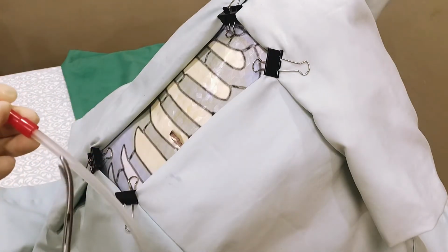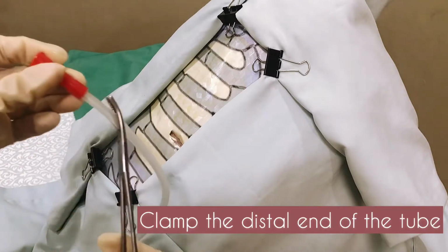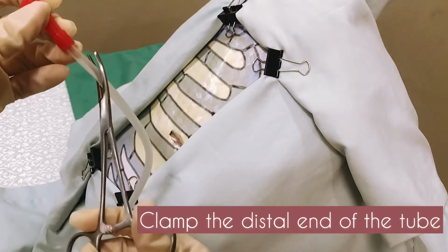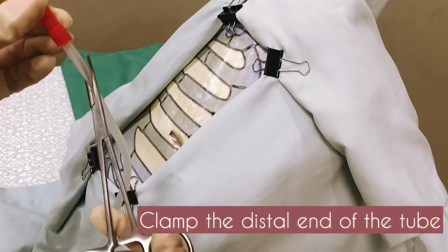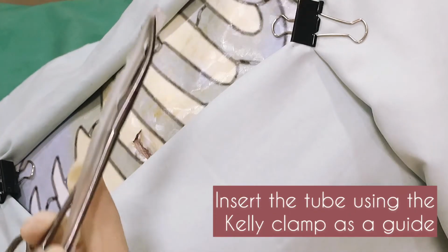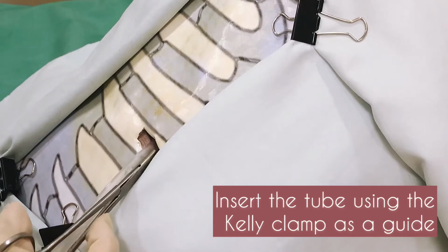If hemothorax is suspected, it is also advisable to clamp the very distal end of the tube to avoid making a mess. Insert the tube into the chest using the large Kelly clamp as a guide.